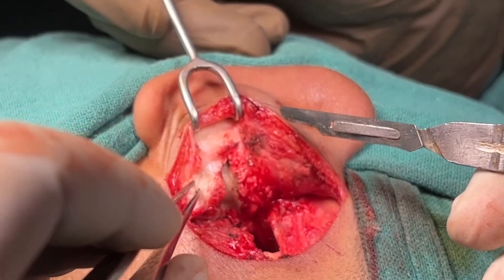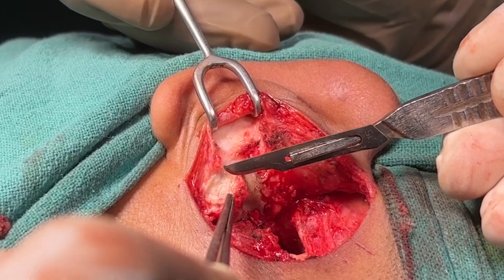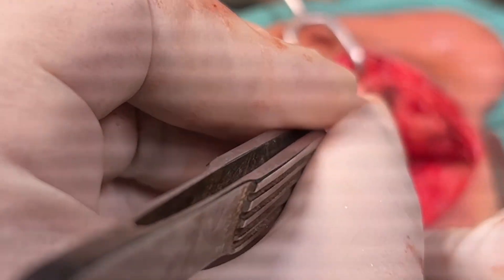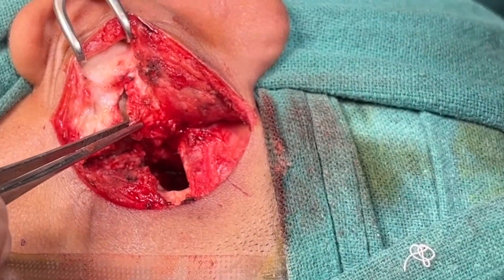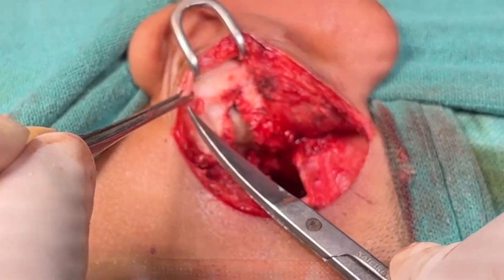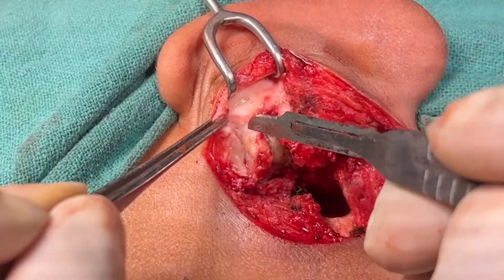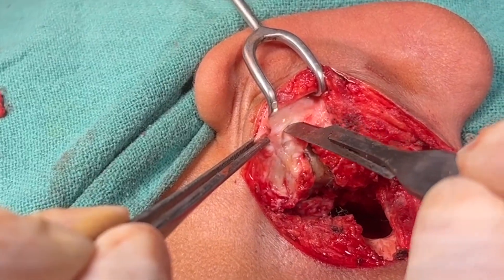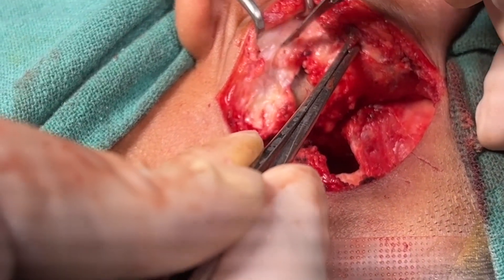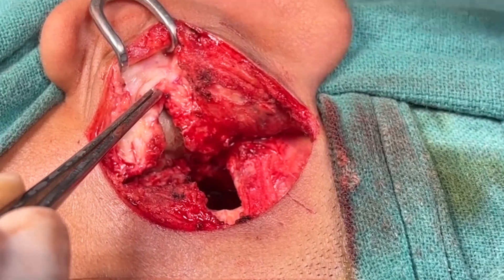This should also be done from the inferior meatal wall. I have completely removed the soft tissue beneath the concheal cartilage. Now I am cutting a piece of concheal cartilage in the form of a crescent shape so that the meatal wall is wide open after removing this cartilage. I am carefully removing this concheal cartilage, taking care not to injure the skin beneath it.